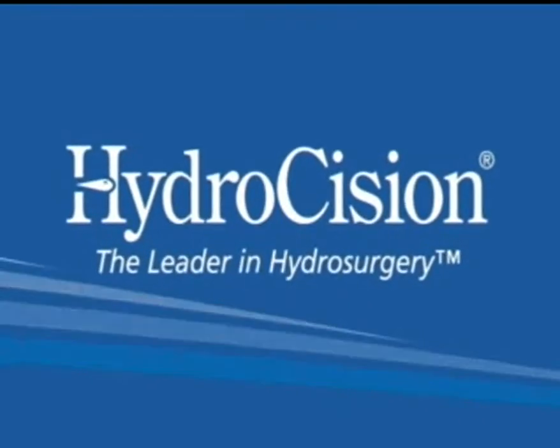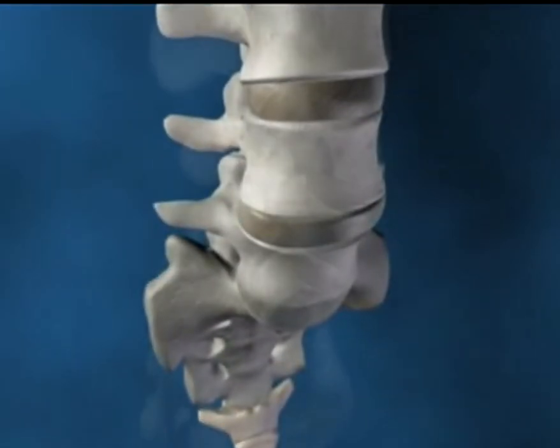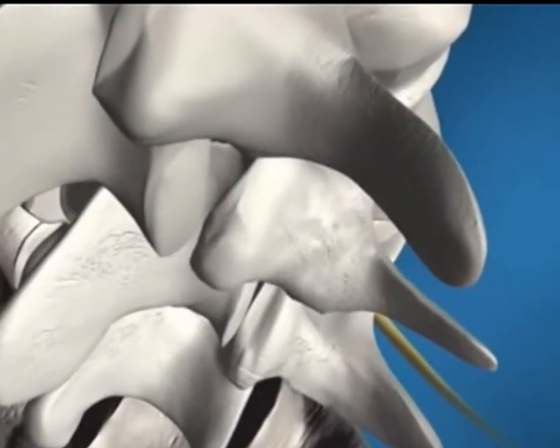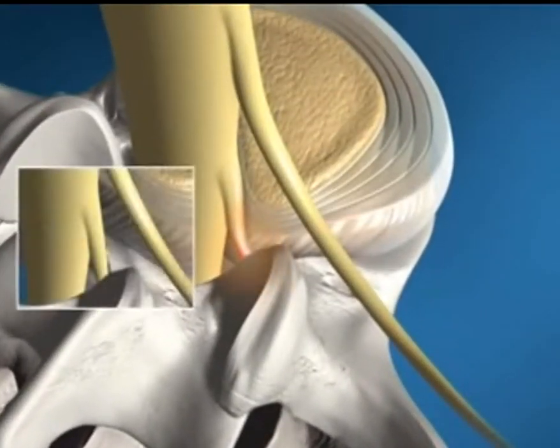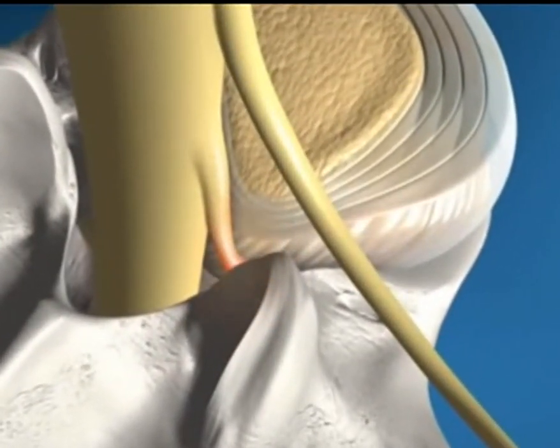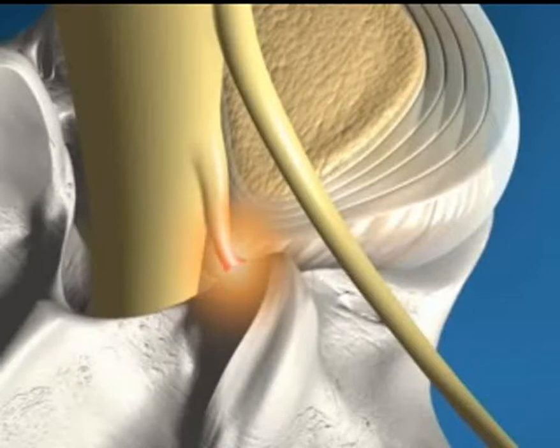The Hydrocision SpineJet Micro-Resector is a minimally invasive instrument providing the latest technology for lumbar discectomy of contained herniated discs. A recent Design Excellence Award winner, the Micro-Resector was designed to be simple, accurate and safe, providing reproducible results.